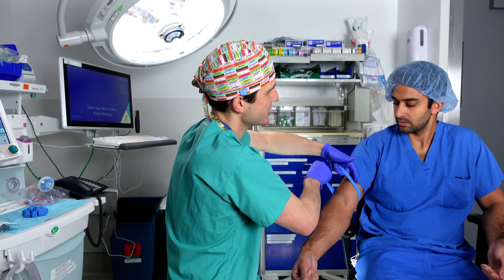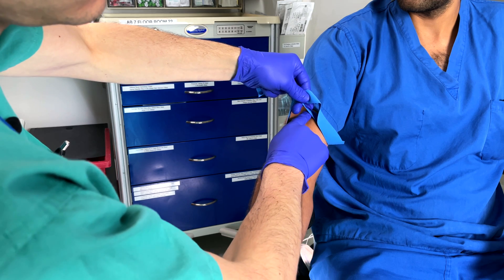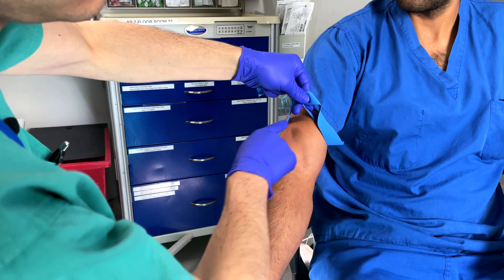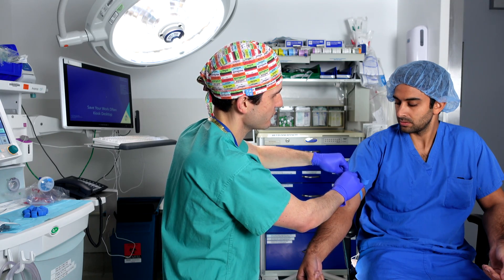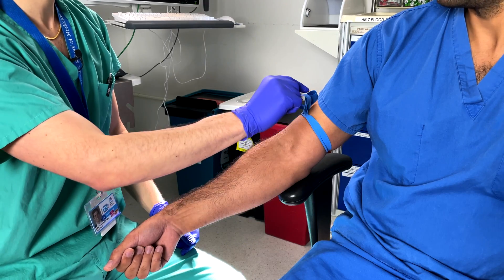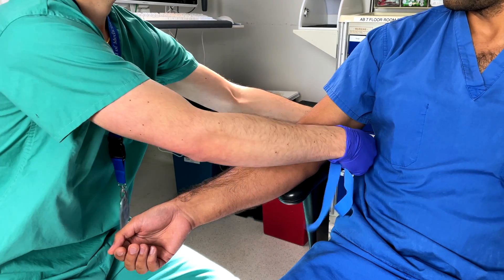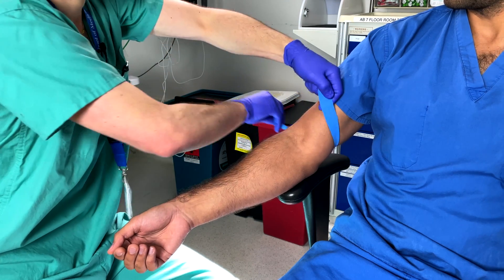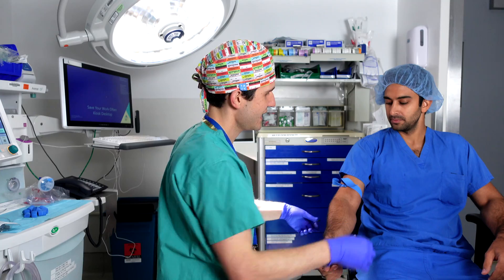I also want to point out that this strategy allows me to make a tourniquet as tight as I need to while maintaining space between the tourniquet and the patient's arm, so that body hair is not pulled tight, which can be very uncomfortable for patients. This particular strategy is also very nice for a quick release — all I need to do is pull a little bit on this end and the entire tourniquet undoes itself. This is what the whole process looks like start to finish. And now I'm ready to perform my IV placement or my blood draw.